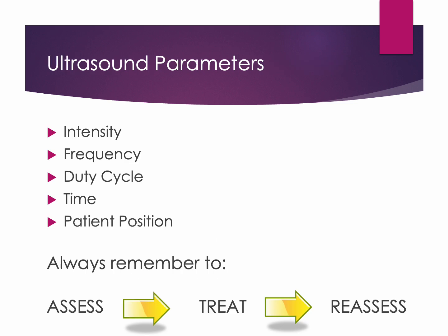When using ultrasound, you need to consider several key parameters and how each impacts treatment. These parameters include intensity, frequency, duty cycle, time, and patient position. Like learning any new language, it is important to understand what each of these values means and the units of measurement for each.